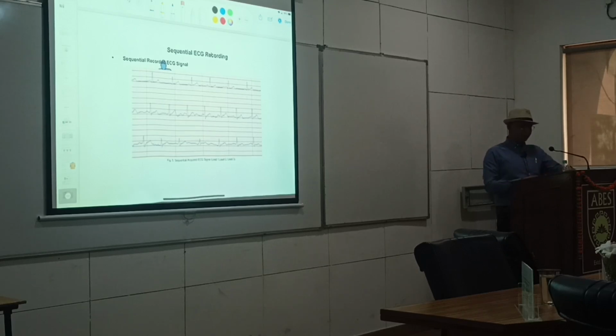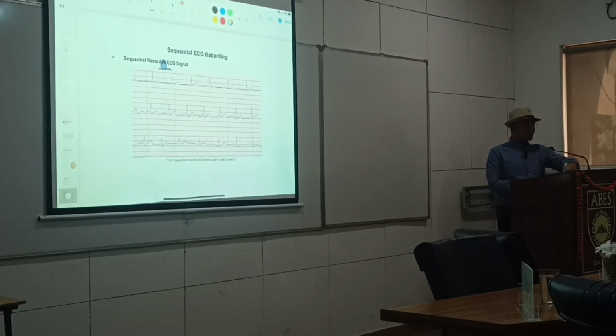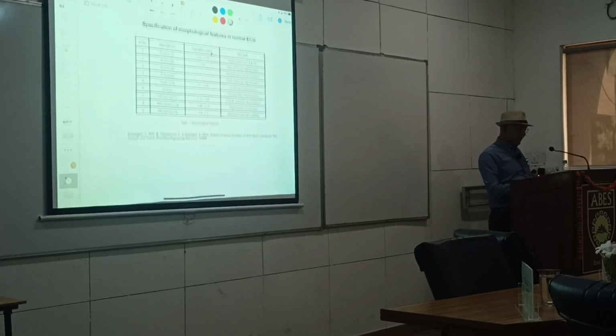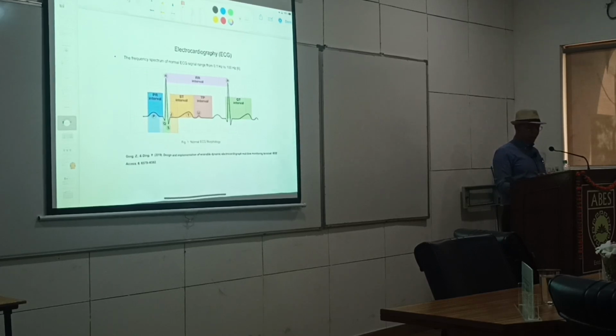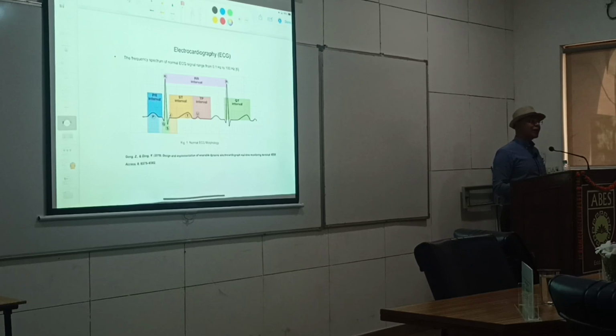Yeah, certainly. In fact, how are these quantified? Quantified means what is the numerical interpretation of these systems. Right, so if you see here, this waveform is the ECG waveform. Now in the ECG waveform, when the RR interval is large or ST elevation is there, let us take ST elevation as an example. Where is ST elevation? You can see here is the T wave.